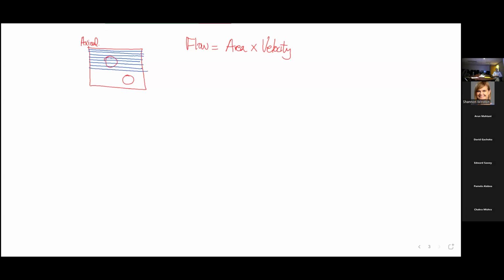Now they're in blue on the screen. I'm going to make some bigger ones because I'm not going to draw 256 of these things. Remember, we've got them in 2 directions, right? Trying to kind of space these things out. They're all supposed to be equally spaced.